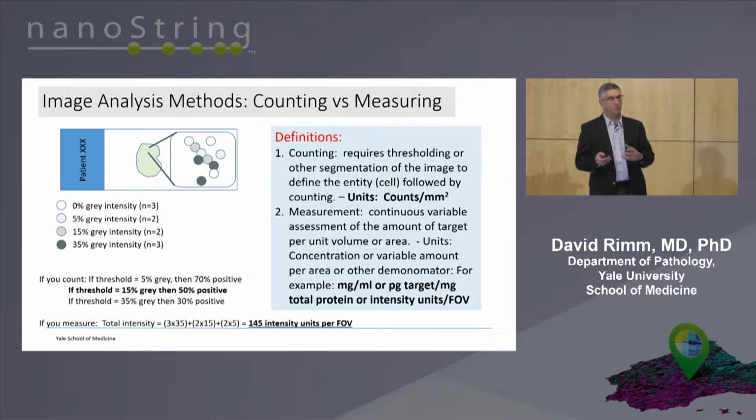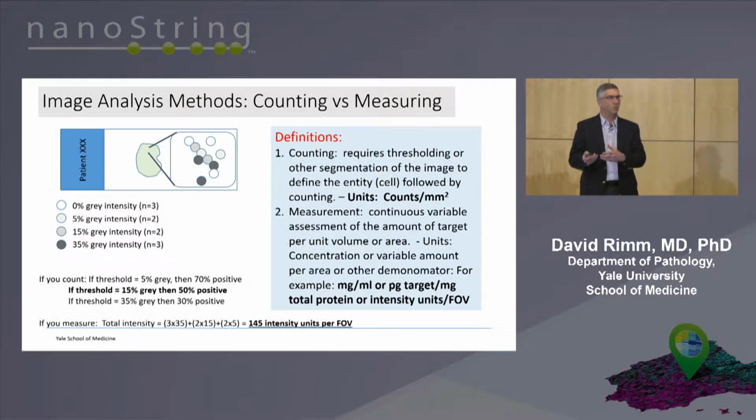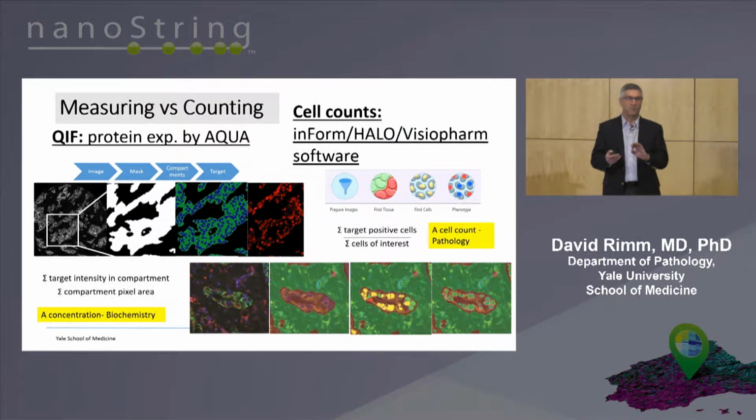I think both are important. And there are sometimes where you want to threshold and count, and other times where you want to measure. But one of the strengths of DSP is measurement, and that's why I wanted to bring this up beforehand, because it allows you to get a true field of view measurement.